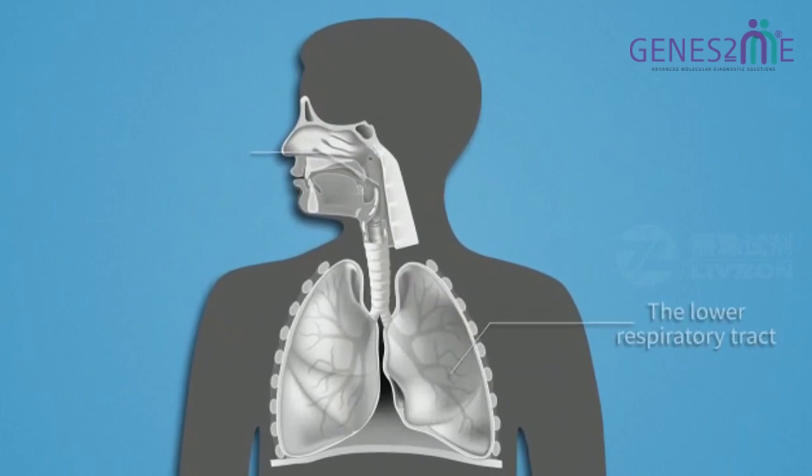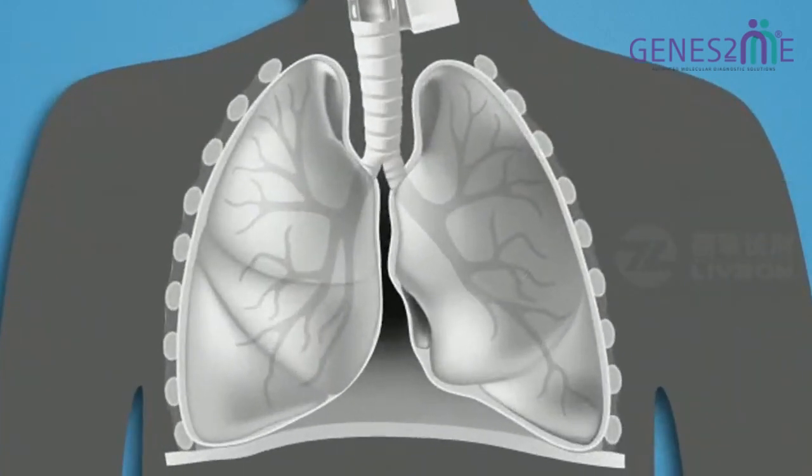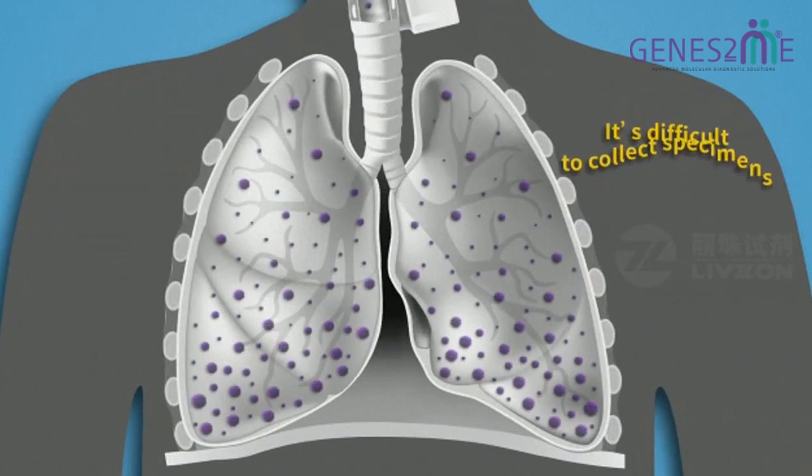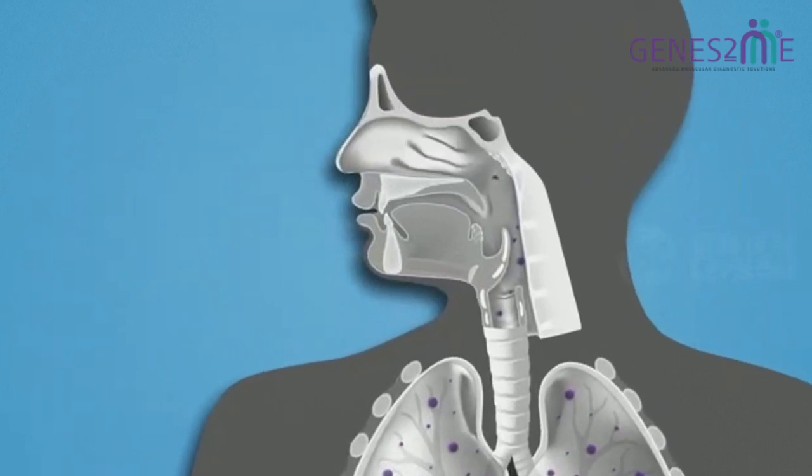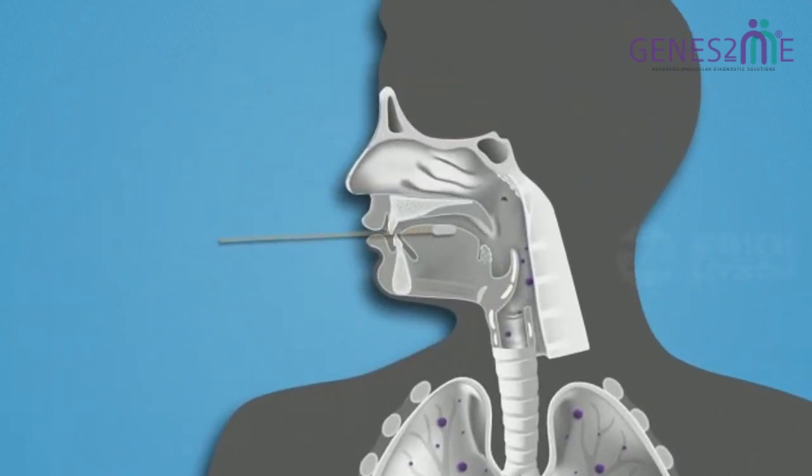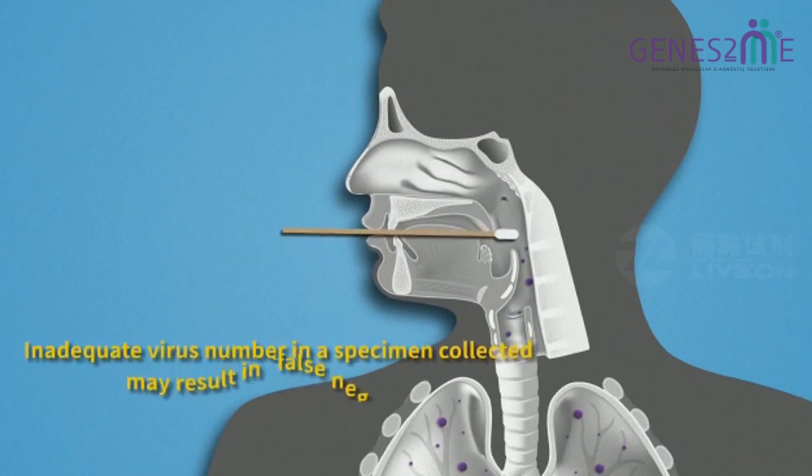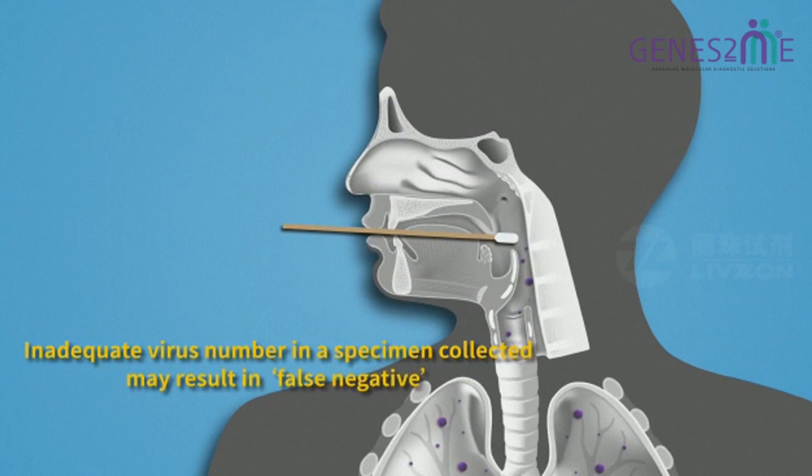False negative is first caused by sampling problem. SARS-CoV-2 mainly locates in lower respiratory tract, but specimens from there are difficult to be collected. Actually, specimens for NAT are commonly collected from upper respiratory tract, such as throat or nasal swab. Inadequate virus number in a specimen collected may result in a false negative.